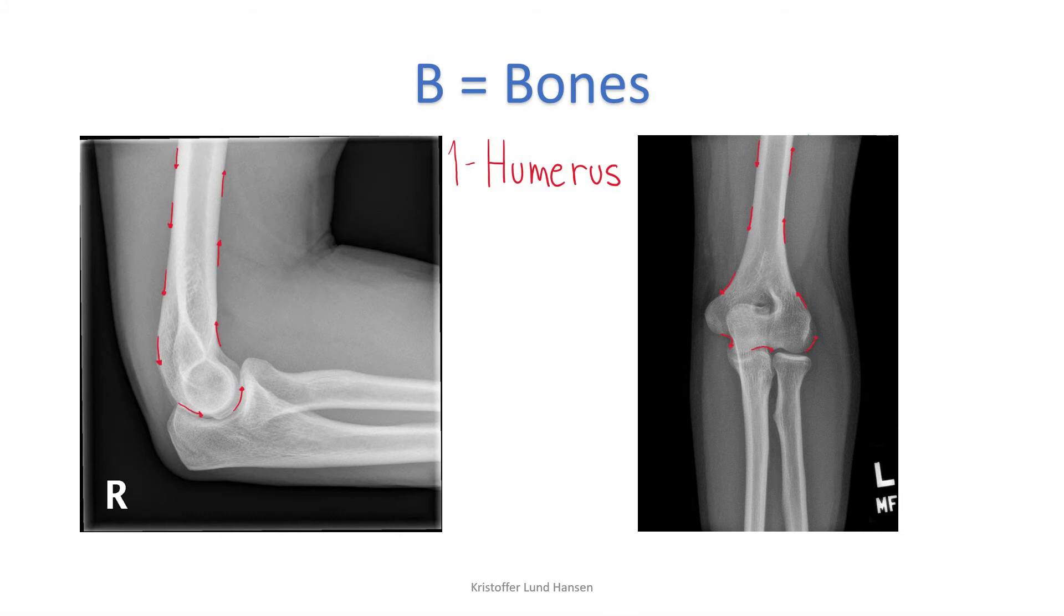First, do the humerus. Start from one side at the most proximal part. Which side it is doesn't matter, but continue all the way around until you're done with the whole bone. It is really important to scan the cortex of the whole bone, as otherwise it is easy to miss out on a possible fracture. Second, you go with the ulna. Again, start with one side and scan it all the way around. Lastly, you have the radius, and you do the same thing. Start on one side and scan it all the way around.